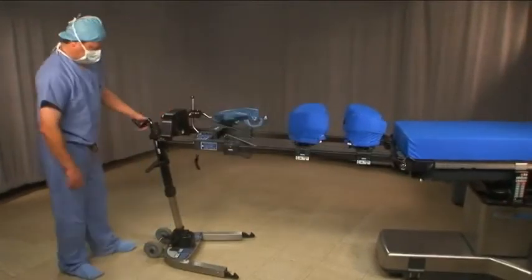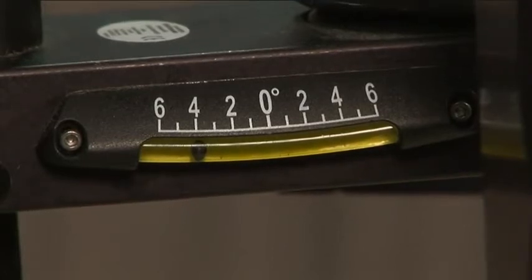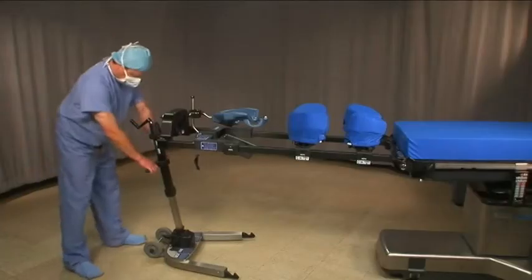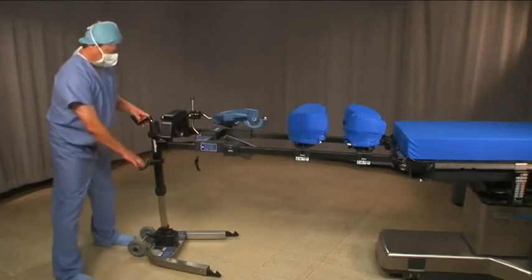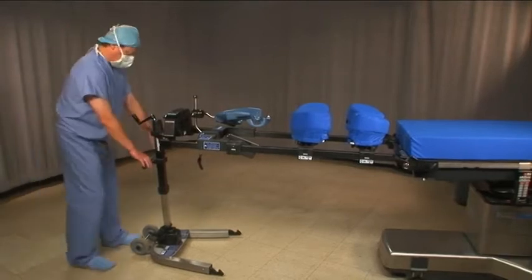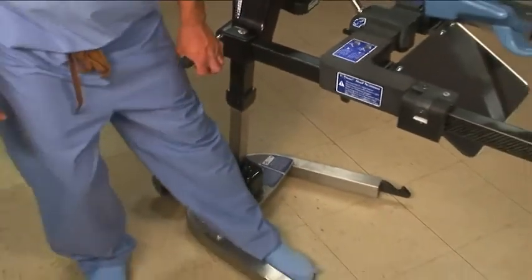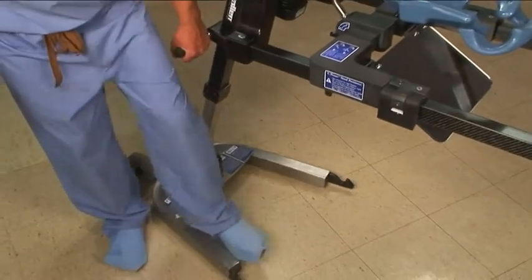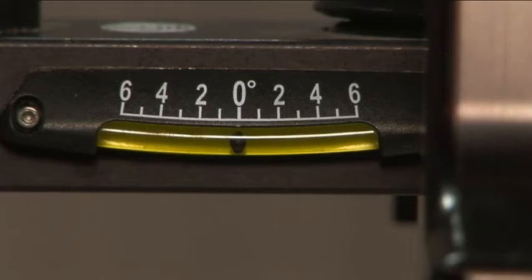Check the bubble level near the handle crank. If the bubble is not centered, you will need to adjust the position of the base. To move forward and backward, place your foot behind the wheel axle and slide the base by pushing or pulling with your foot. To move side to side, place your foot on the inside of the base and pull towards you. Recheck the bubble level. When the bubble is centered, the base is in the proper position.